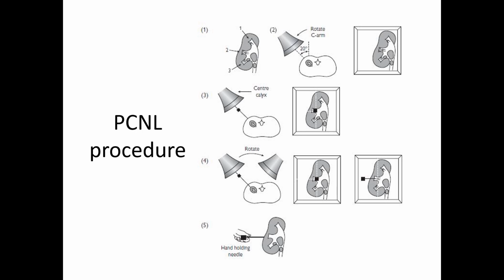These are the sequential steps showing the fluoroscopy or X-ray to gain access into the targeted calyces. It's step by step.